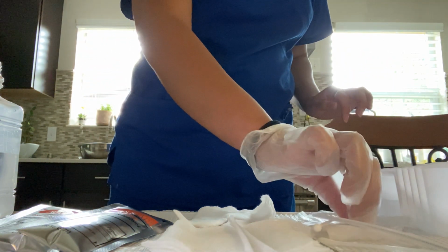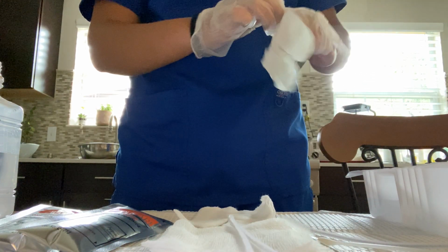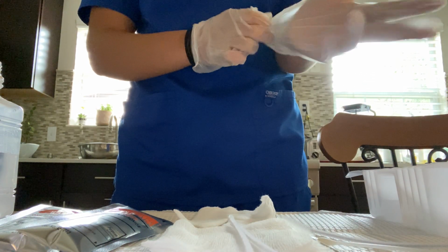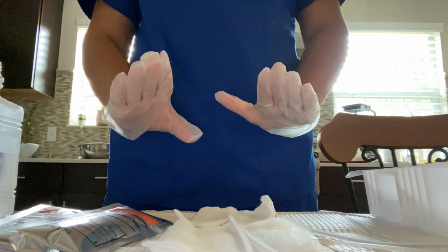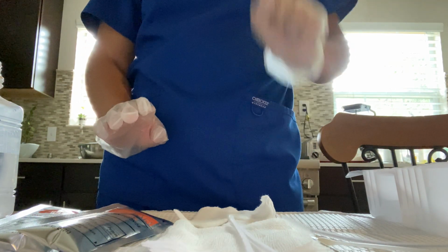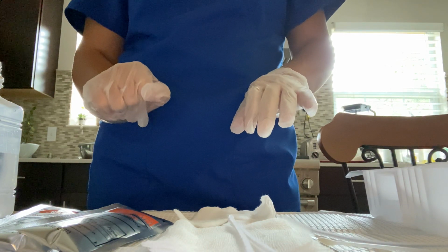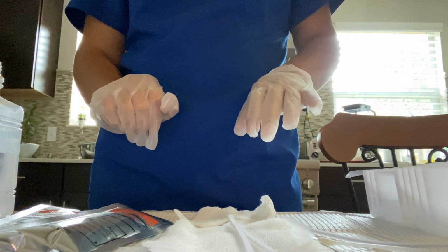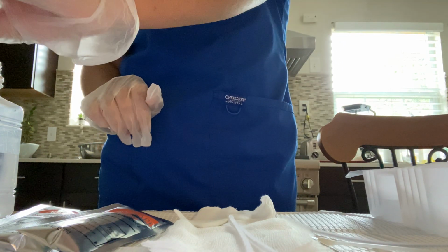So we're just going to not break sterile technique. Other sterile glove is on. We stayed sterile. One hand will become my dirty one, so it'll be my left, and then my right hand will be sterile. So that's my sterile hand, my right. Then my dirty hand will remove the trach. Okay, we removed it.